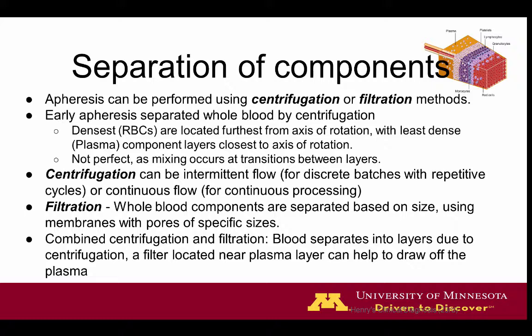This method is not entirely perfect, as in the interfaces between the areas of separation there are some levels of mixing. So if one were to draw, let's say, red cells close to a transition point, you might also get some granulocytes, which could potentially cause some issues when it's being transfused into a patient.